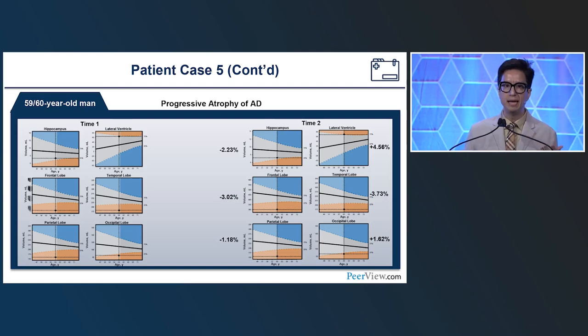So if you're reading a study and you're not sure if these low brain volumes at one time point mean anything, get a follow-up scan in a year and you'll have greater confidence in the progressive atrophy. And of course, perhaps having other fluid biomarkers of Alzheimer's disease pathology as well.